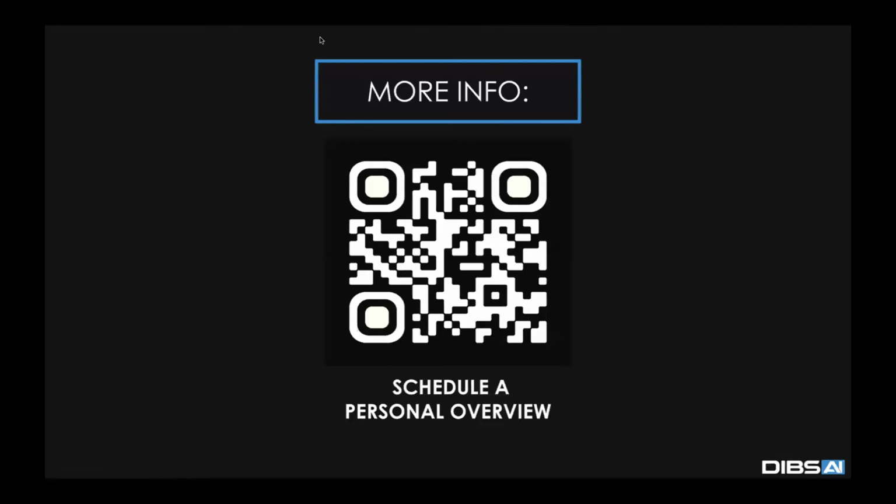Well, actually, one more question before we end, Brandon. This is for you. A user says they've used Light Force and they get a ton of broken brackets. Do you get similar issues with DIBS?